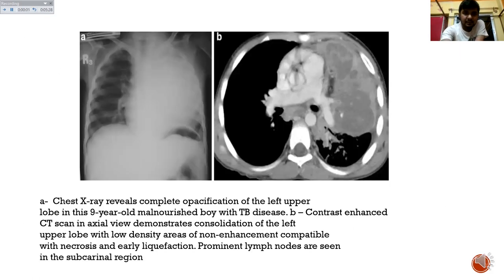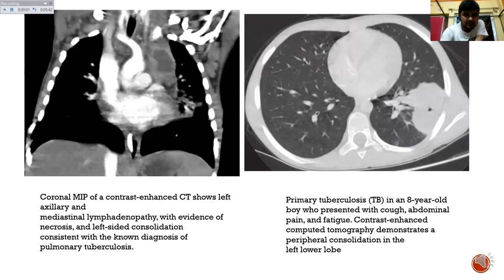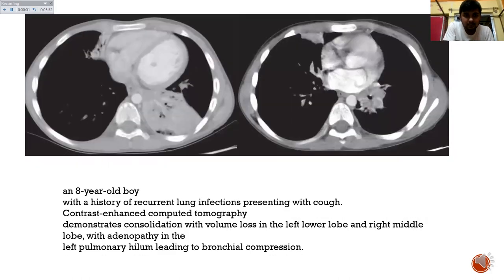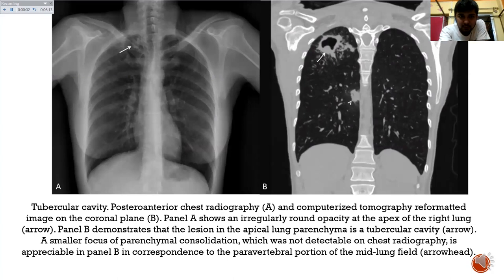One case is a nine-year-old malnourished confirmed TB patient. Chest X-ray shows opacity in the left upper lobe, and the CT shows a subcarinal region with a prominent lymph node and contrast-enhanced mediastinal lymphadenopathy with necrosis, along with peripheral consolidation in the left lower lobe. Another case is an eight-year-old with recurrent lung infections and cough, showing consolidation in the left lower lobe and right middle lobe, with left pulmonary hilar compression due to bronchial compression from enlarged hilar adenopathy. A further case shows cavitation in the apex of the right lung, corresponding to CT findings.